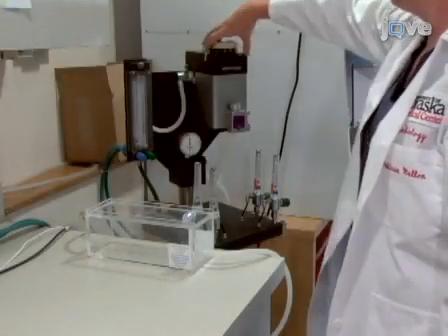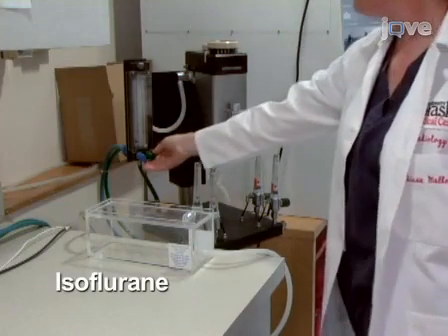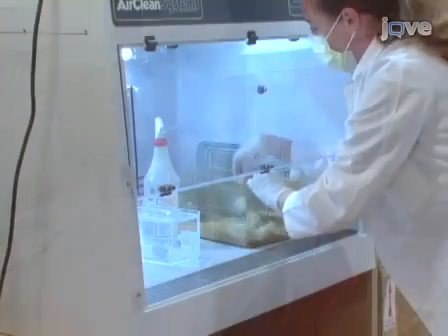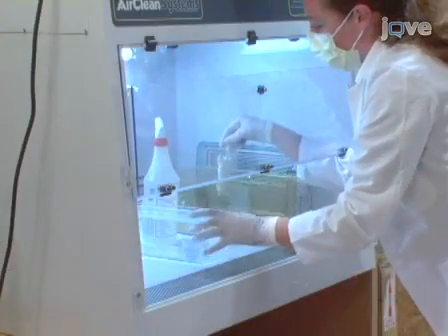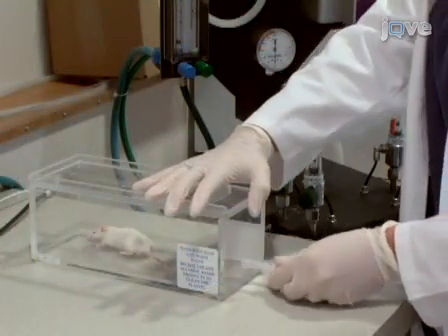Prior to scanning, place the animal in an anesthesia chamber pre-filled with the anesthetic gases. This will speed the onset of anesthesia and minimize the amount of time required to ensure that the animal will not wake up upon removal from the chamber.